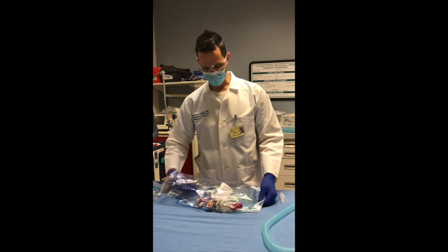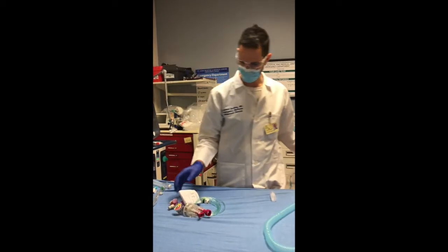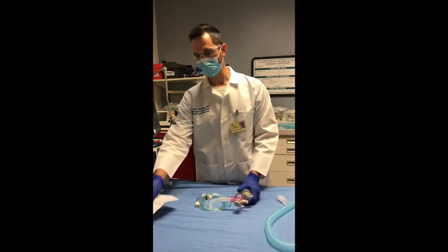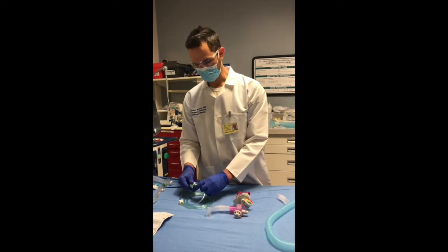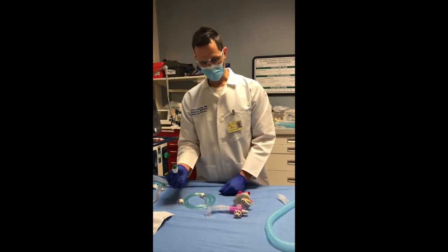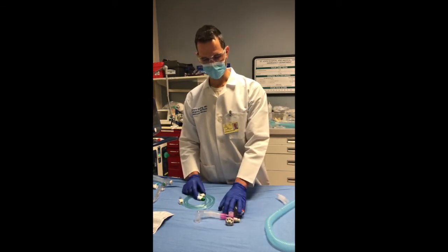When you unbag your Vortran, there are only a few pieces to it. You'll have the tag, which actually goes pretty well through how to set it up, so that's always your friend. You have your oxygen tubing. On the oxygen tubing is your FiO2 device, which will help you set how much FiO2 you're going to get, and then you have the ventilator itself.